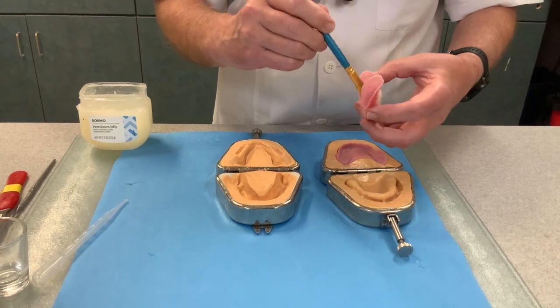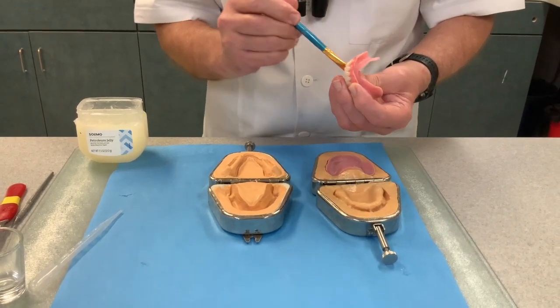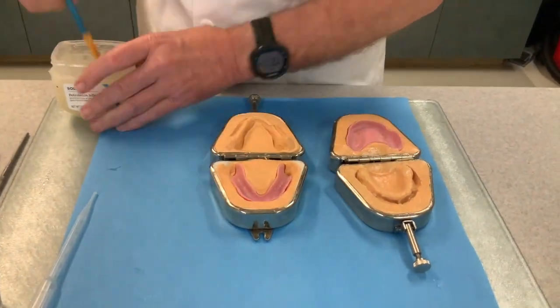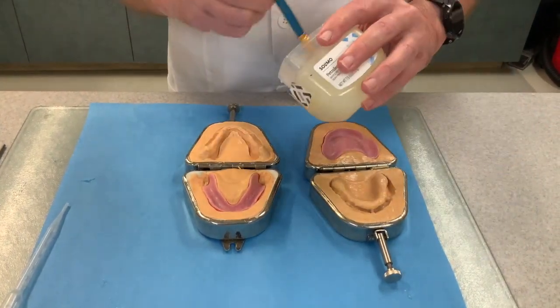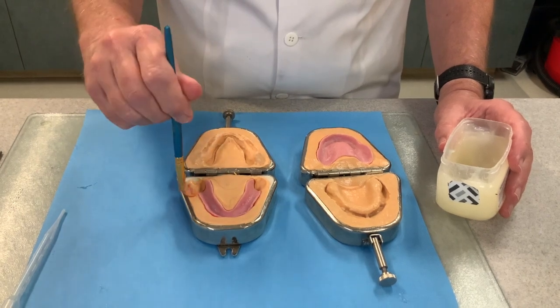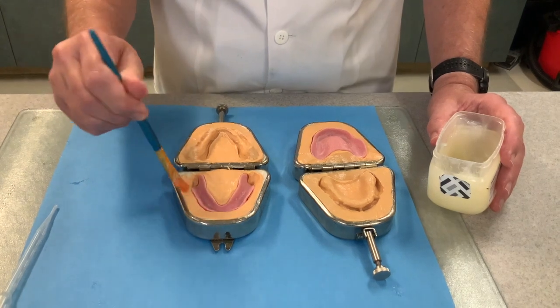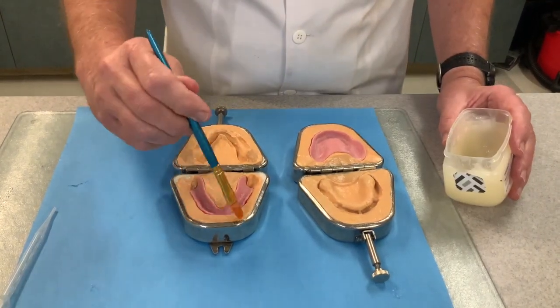These duplicates will also serve as her spare denture after we make her final. I'm going to put that tooth-side down and then put a little Vaseline on the putty surfaces. This is just a releasing agent. We worried when we were first fabricating and coming up with a formula for flow cast — would the Vaseline retard the set? What we found is we tried a whole bunch of different separating mediums, and Vaseline is the best, so we went back to Vaseline.